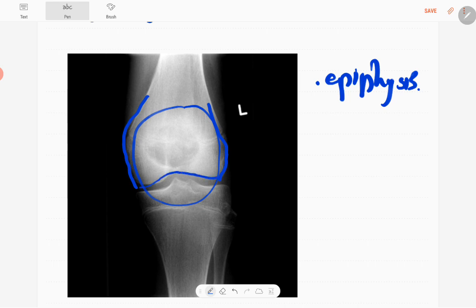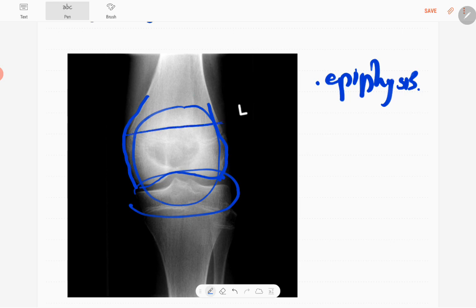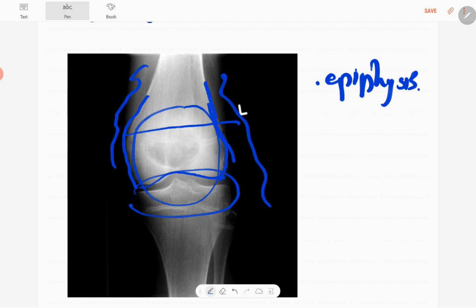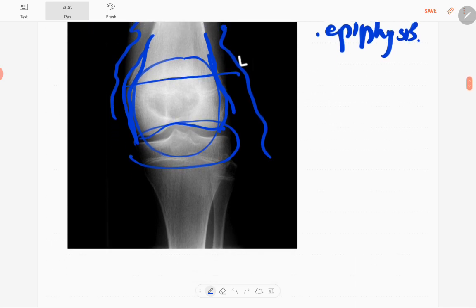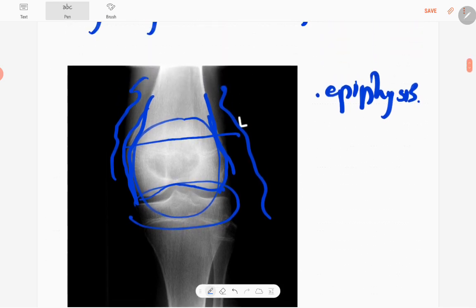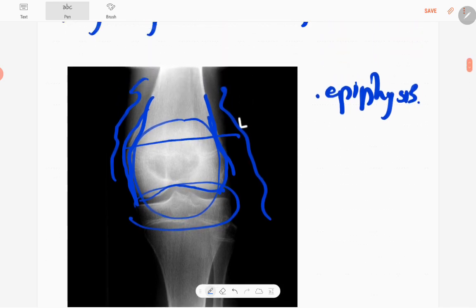Articular surface is normal, knee joint is normal, and it has a narrow zone of transition. No soft tissue component in this region, no periosteal reactions, no pathological fractures, and no synchronous lesions.